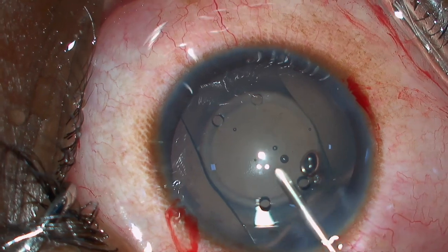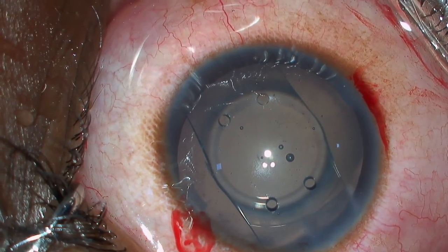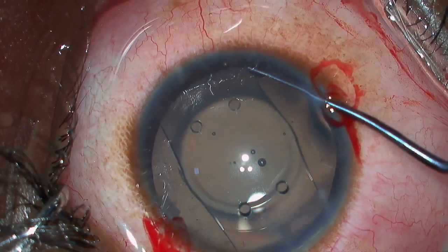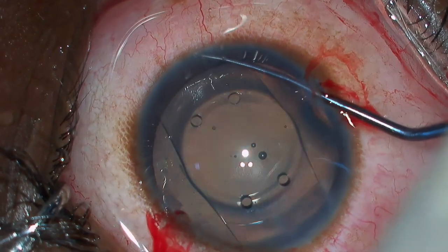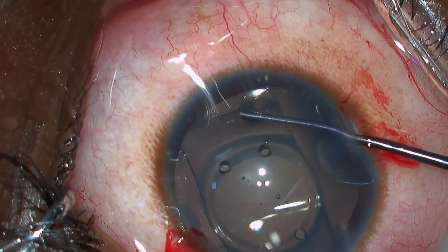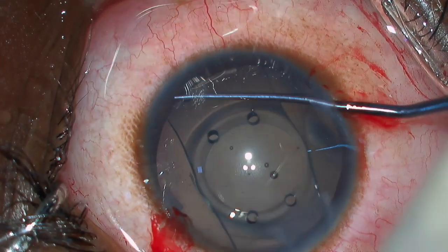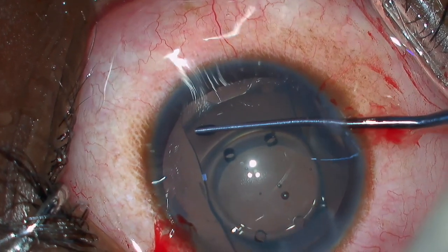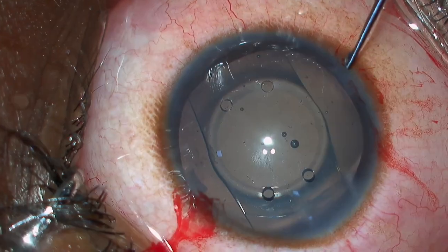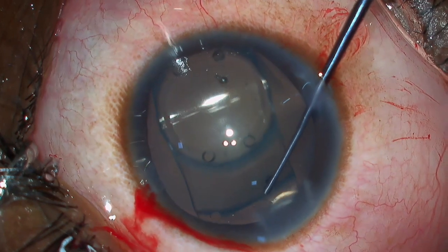Inject viscoelastic over the RIL and then slowly start tucking all four haptics under the iris. The important point is to go till the periphery and then with a slight depression try to go under the iris. The same technique is done on either side.